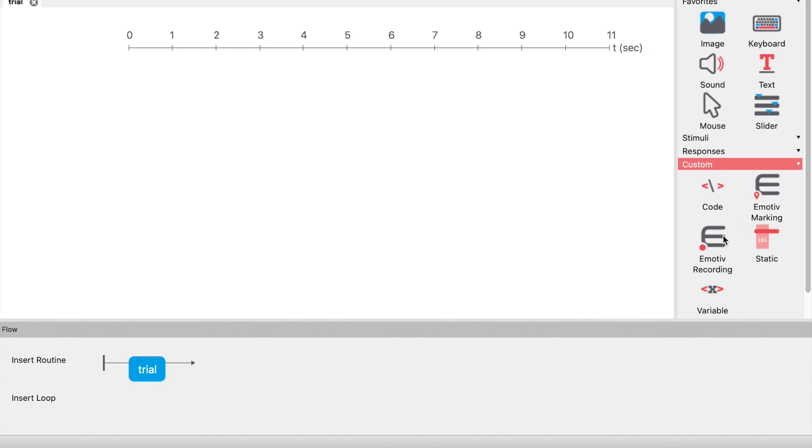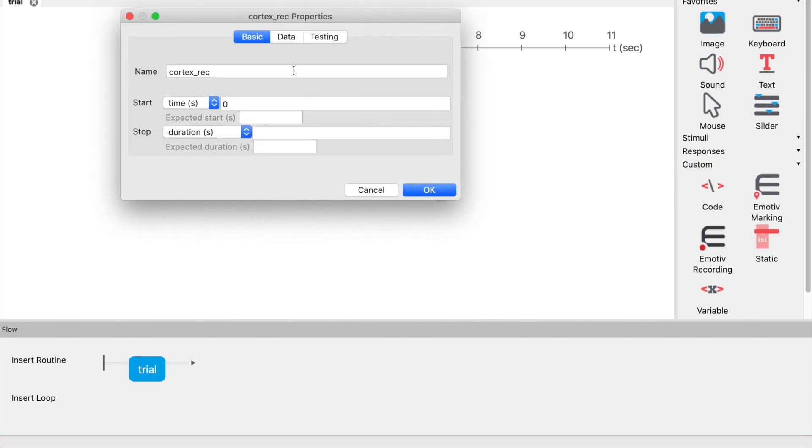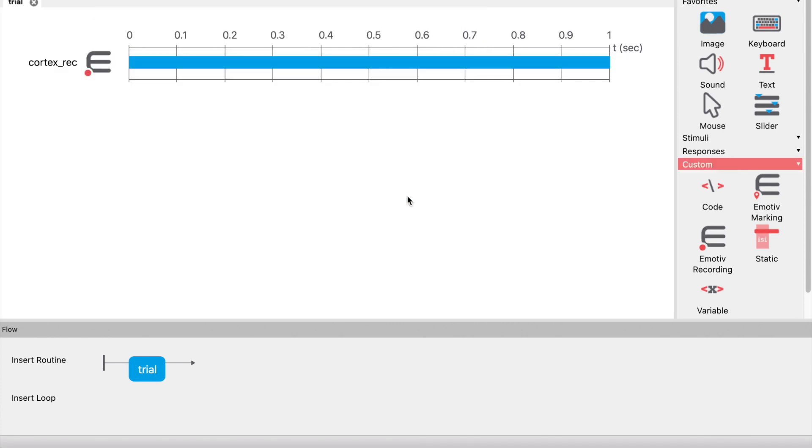Now let's build the experiment. Open the build module and add an EMOTIV recording component, accepting the default values.